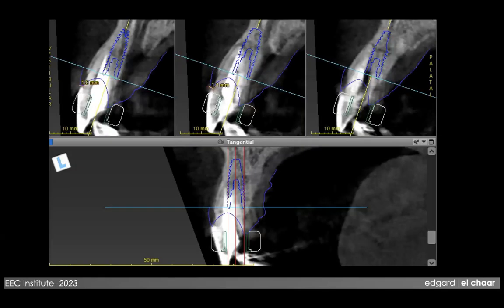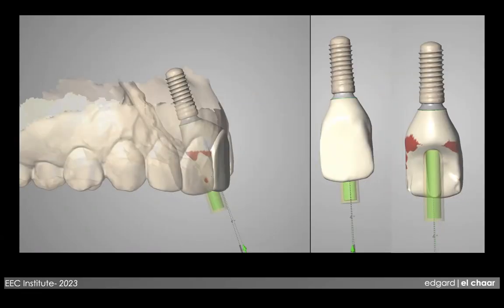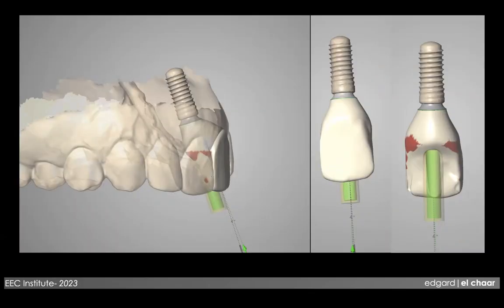And going back to it, we do an extraction of the tooth that is digital, and I have put some videos on YouTube on how to do that using a mesh mixer. And then you can design the temporary made with the implant placement when you synergize two software. So now it becomes more sophisticated from the time that I wrote the paper on immediate implants, where we used to do them without any control or end goal. We were planning, but we were doing it haphazardly. And now with the technologies, we don't guess anymore.